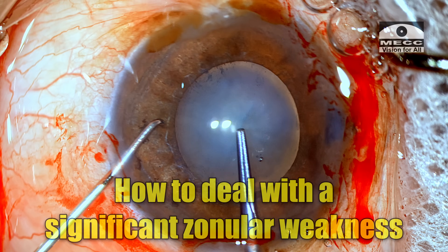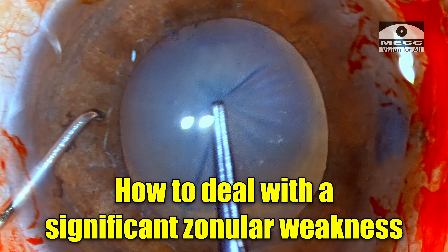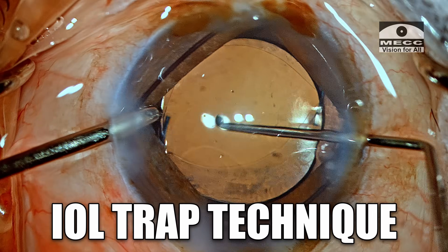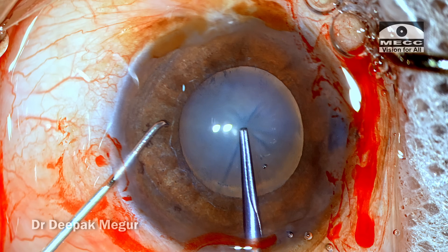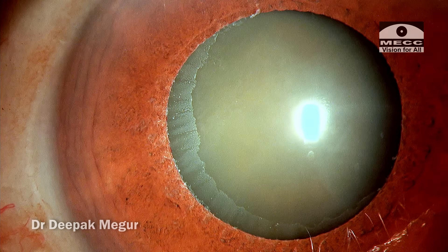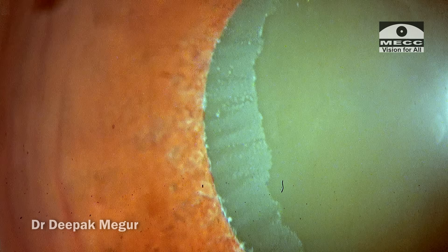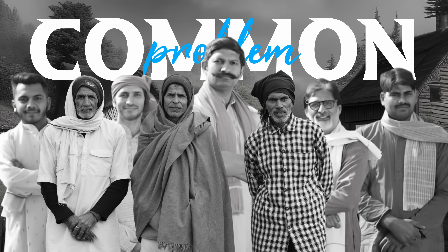How do you deal with a case which has got significant zonular weakness such as this? I'm going to demonstrate the IOL trap technique in one such eye. In my practice, probably every fifth case in my list is going to be a patient who has pseudo-exfoliation. It is so common in our country and we see quite a lot of these patients.